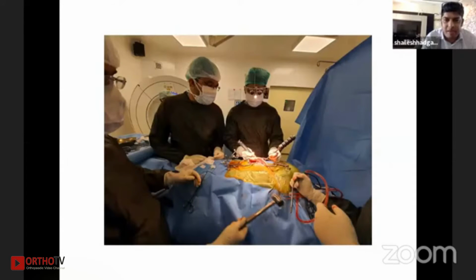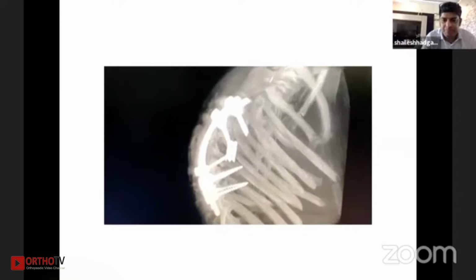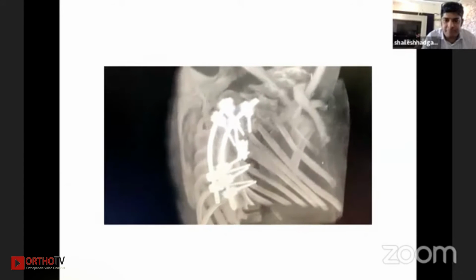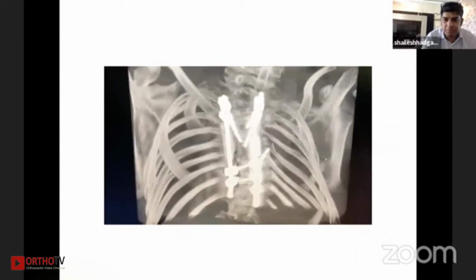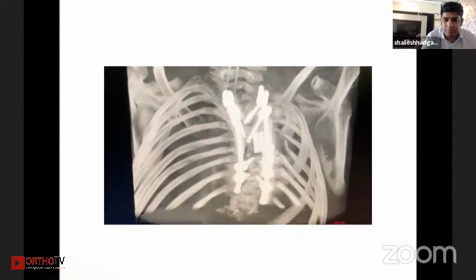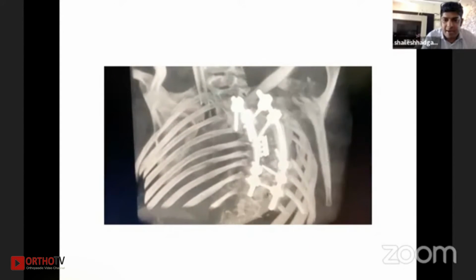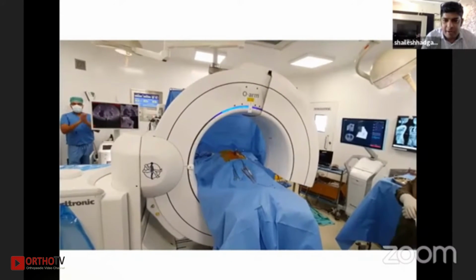You can do osteotomies under this OARM, and this is what the deformity was, and we were lucky to get almost 70 degrees of correction in this 125 degree thoracic kyphosis. We are doing the recording of the post-op X-ray on the OARM, and this is really showing us exact placement of the screws and significant correction in this very severe congenital kyphoscoliosis. You mature from doing freehand, and therefore it becomes easy for us to do it. And this is actually what we are doing in the theater.